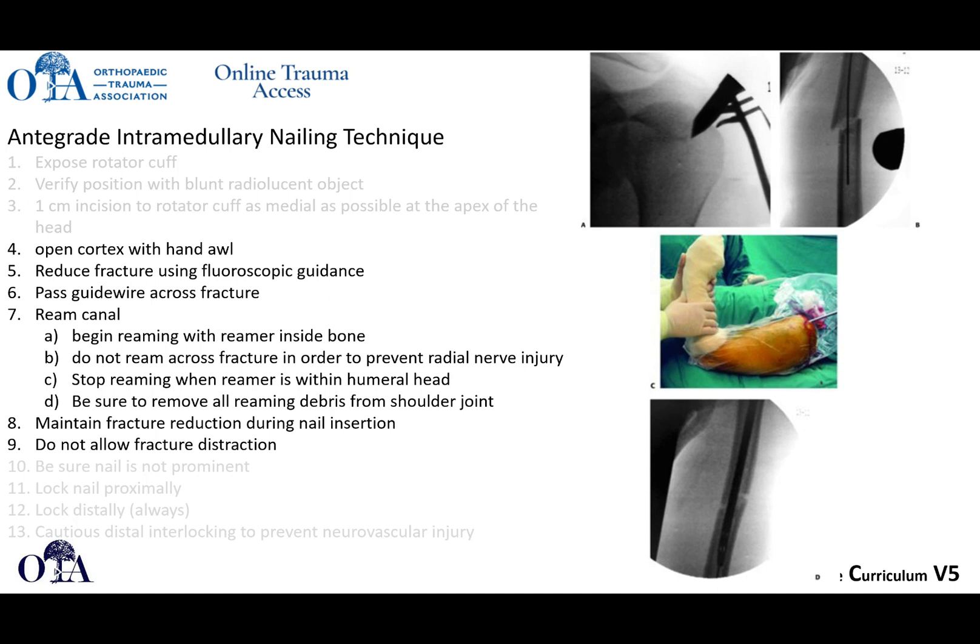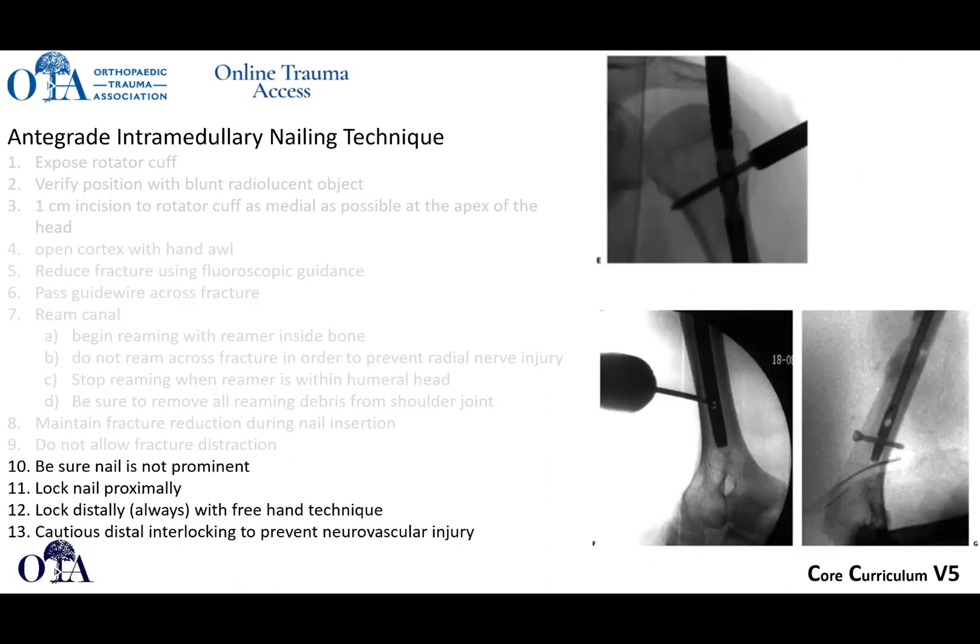Importantly, do not allow fracture distraction. When doing compression plating you can avoid this more easily, but with nailing there's a tendency to get a little bit of distraction, which does not work well with humeral shaft fracture healing. Make sure the nail is not prominent — you want it really countersunk proximally — then lock proximally and lock distally. When locking distally, typically you have to do an open approach using a freehand technique.